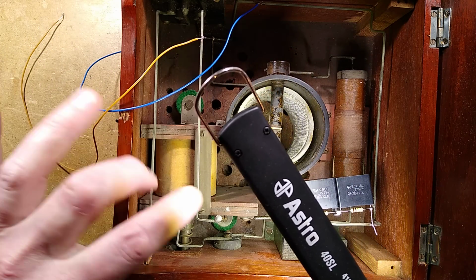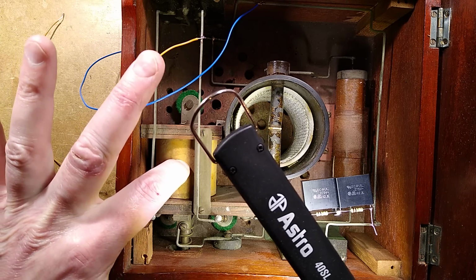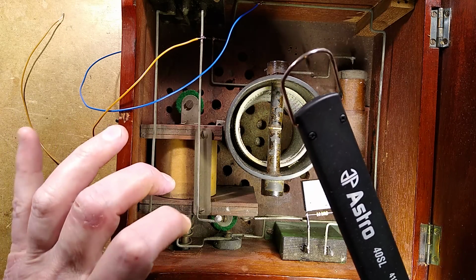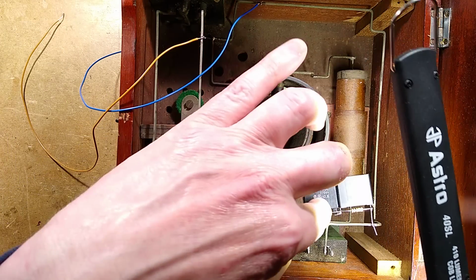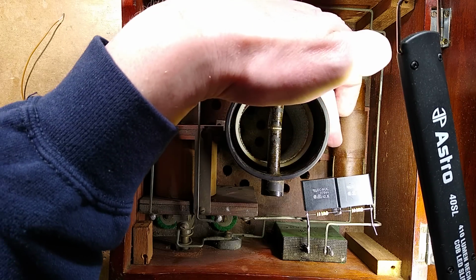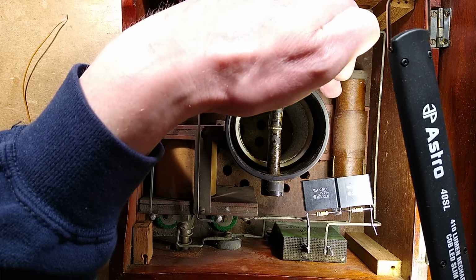There's the main winding and a tap, a midpoint tap, this one, that means you can use it at a lower voltage. But what happens is that every time the contact's open, it puts this capacitor in series with that high voltage coil down there, and it's got a small number of turns on the outside here and then high voltage in the middle. This is very much handmade.